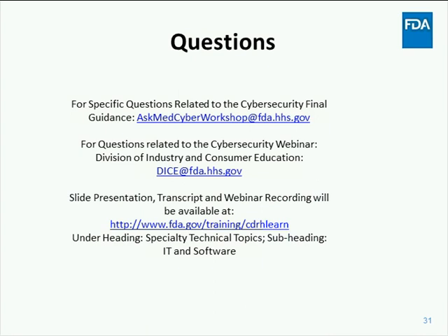I think I understand part of that. But for a recall, if something is classified as a class 2 or class 1 recall, it involves way more than just contacting the customers, because you have to do a lot of follow-up actions, for instance, reconciliation. The actions would be very different depending on the severity of harm you determine, right? So I just wonder what would be FDA's perspective if, because of just one day's difference, one is following the recall process and the other is not. What's the difference there?